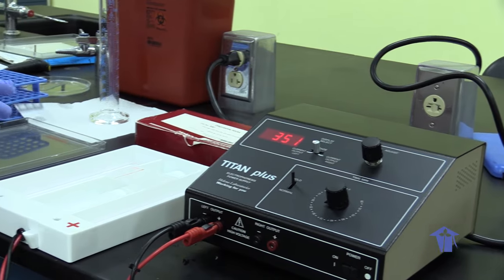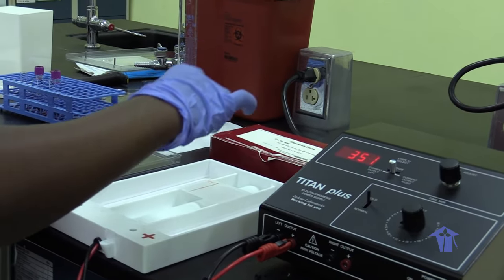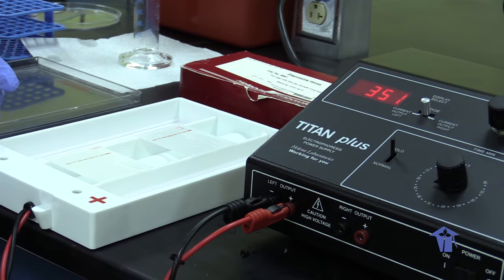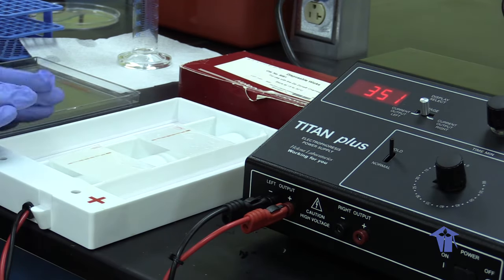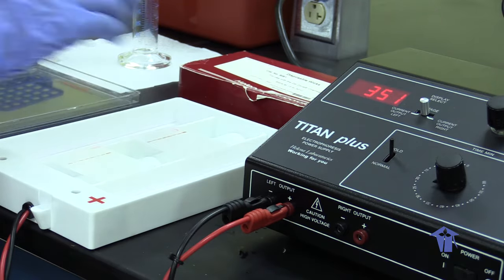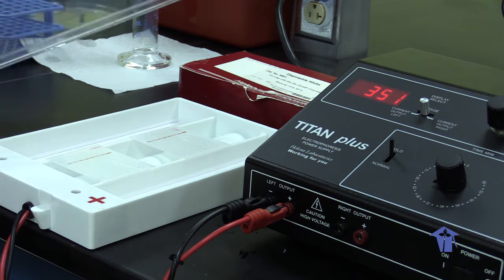Okay, so we have our plates. When we place a sample on it, we need to put it face down with the samples facing more to the negative side of the chamber. It's very important. Face down. So acetate side face down, facing the negative side. Very important.